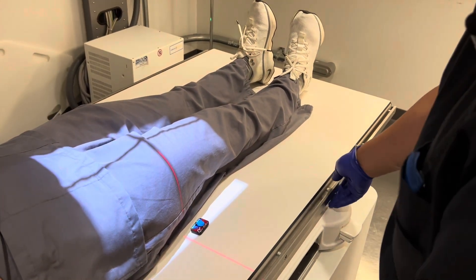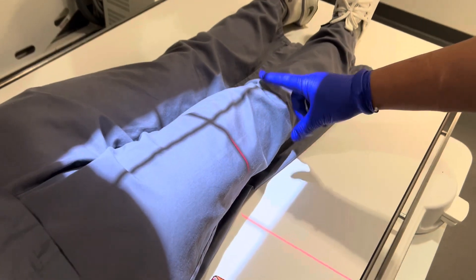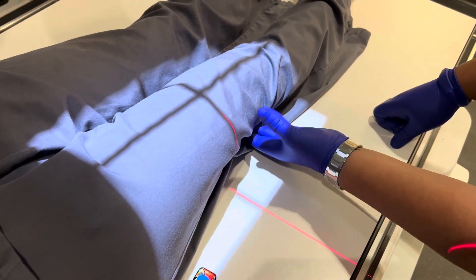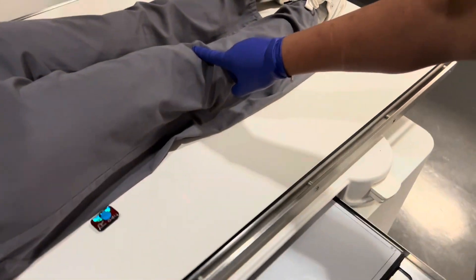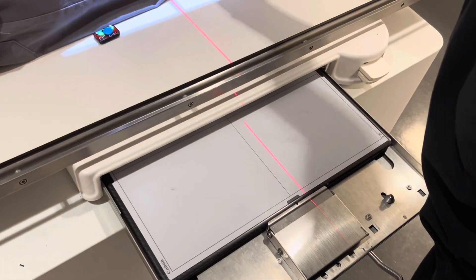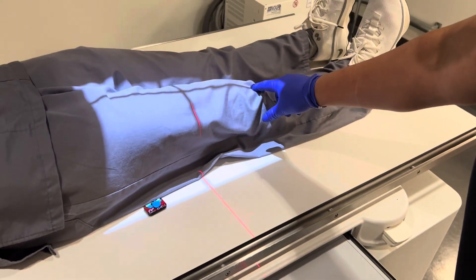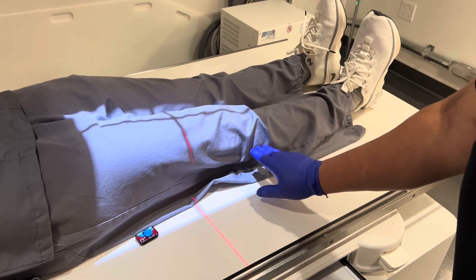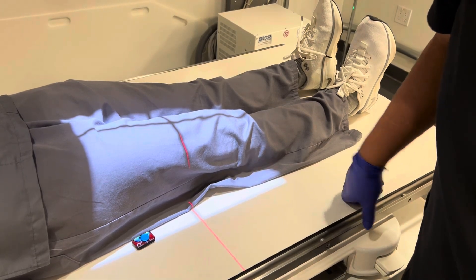For the distal, you're going to come up and go two inches below the knee. Her knee joint is right here, right on the tibial tuberosity. The book says to put it two inches below the knee joint, but I use the tibial tuberosity as my guide because I know that's going to be at least two inches below the knee joint. Her knee joint is here — about three of my fingers — and this is going to be your distal AP. The distal portion, she's going to get about 12.5 mAs at about 72 to 74 kV.